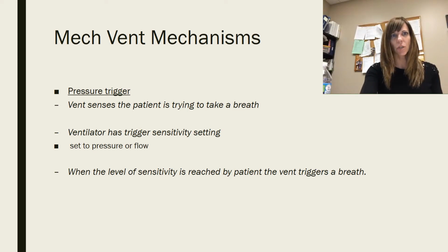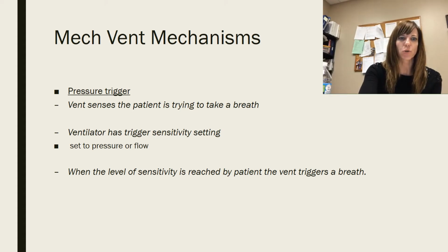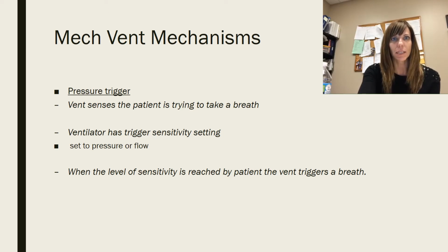Okay, this is chapter 3, still talking about trigger, and we talked about time trigger, which means that you have to set a respiratory rate and that will start a breath. This one talks about pressure trigger. With pressure trigger, the patient has to inhale, which means the patient has to be breathing spontaneously on their own.